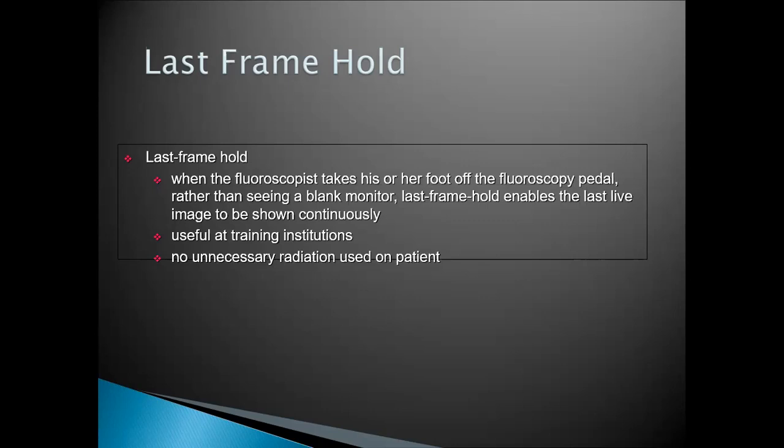Of course, this is useful at training institutions, in teaching hospitals, where we have a lot of doctors in training. It is useful there because they want to experiment with the machine and so on. All they do is make use of the last frame hold so that the patient doesn't receive unnecessary dose.